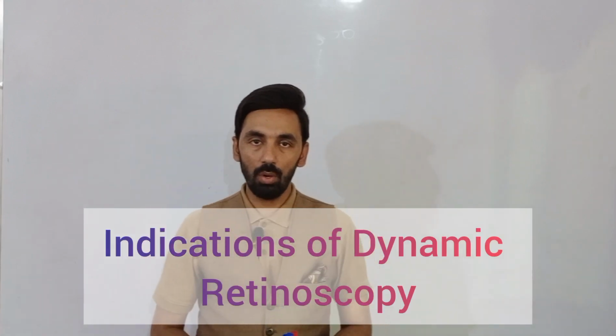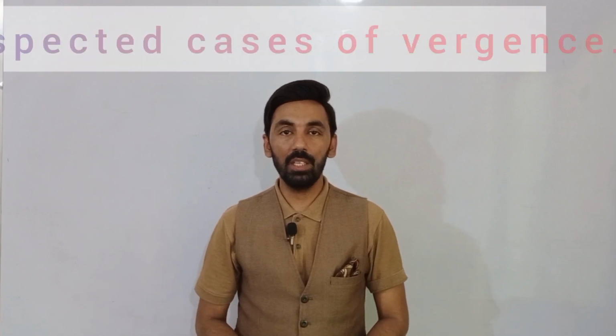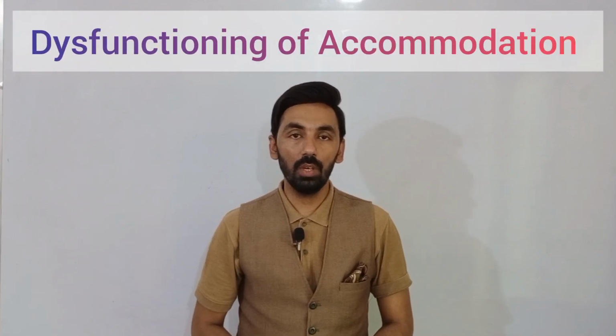And now we will learn about the indications of dynamic retinoscopy, meaning in which type of patients we will perform it. Number one is in every suspected case of vergence problems, the convergence and the divergence. Number two is in every dysfunction of accommodation.